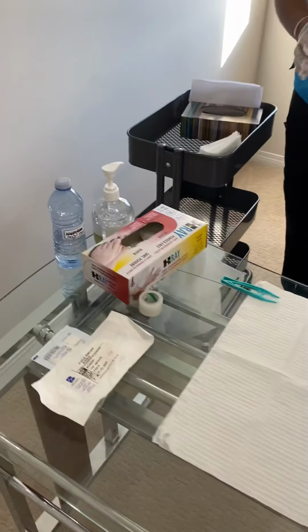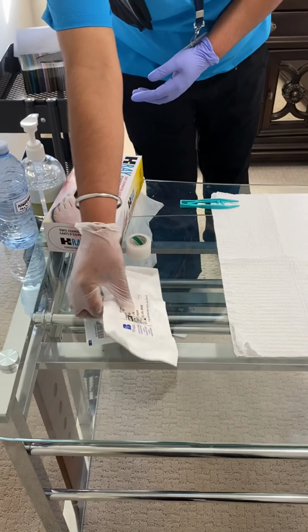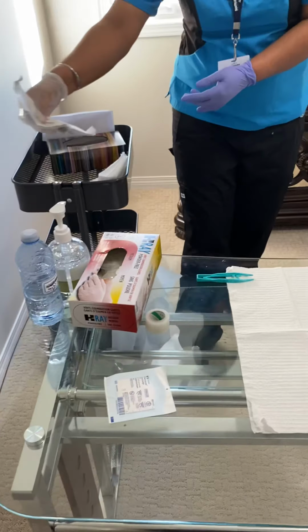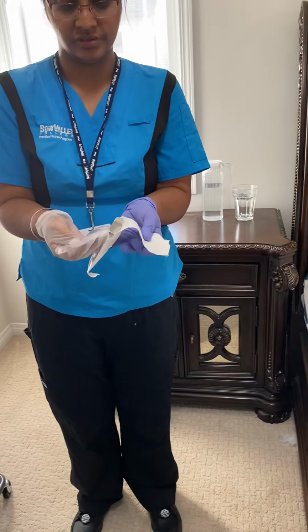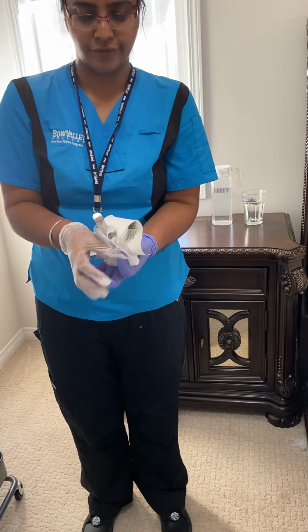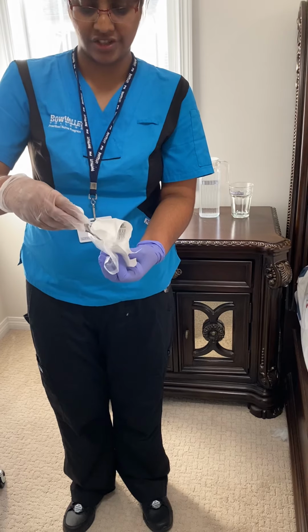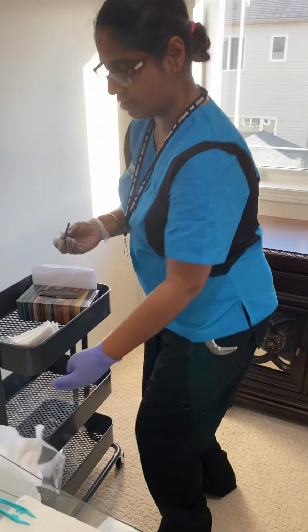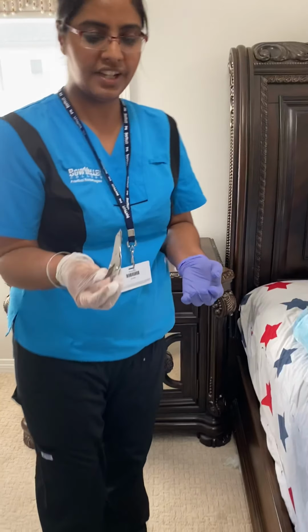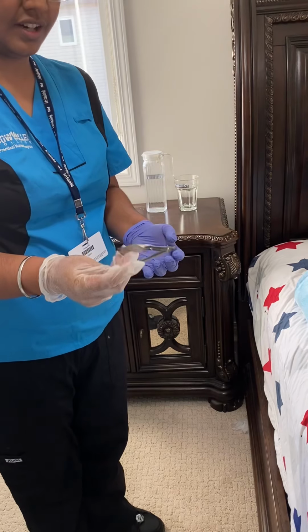So now I take this staple removal kit without crossing my field, and I have to peel it like a banana and take it from the top without touching the inner ends, and put the garbage on the side. Now as you see, underneath there are 2 teeth.